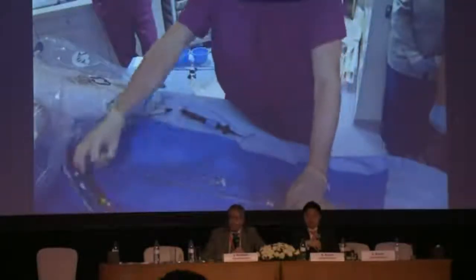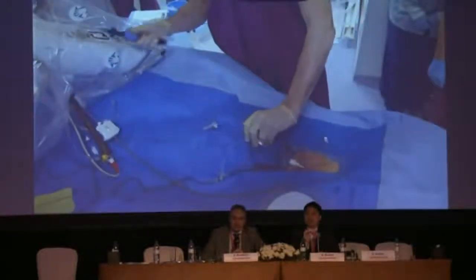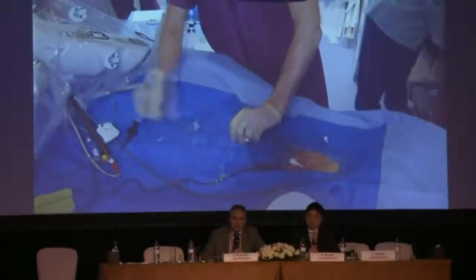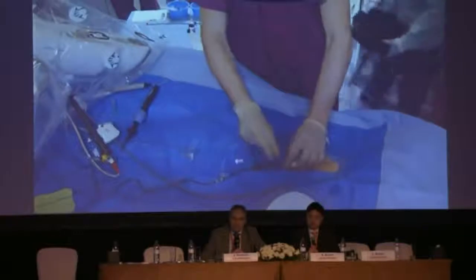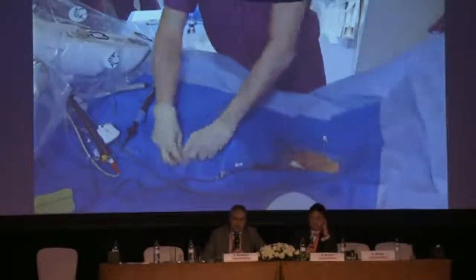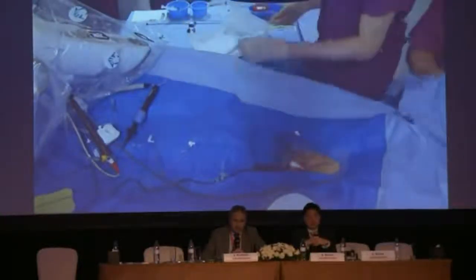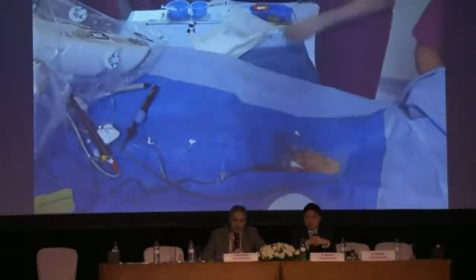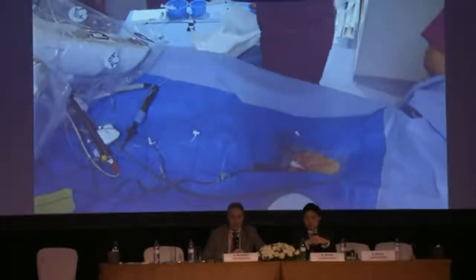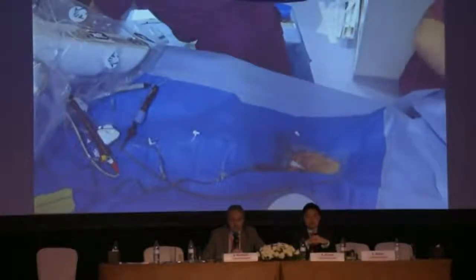Yeah, Professor Schilling, this is Majdi speaking. I want to ask you about when you finished isolation of the pulmonary veins, you went directly to positioning the Lasso catheter at the base of the appendage. Do you sometimes need to perform a CARTO map first, or do you not go for a CARTO map at that stage? So I would do the CARTO map with my ablation catheter if, as we said, we had a fairly fast and difficult activation sequence to map, looking at activation timing.